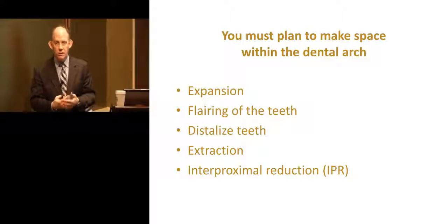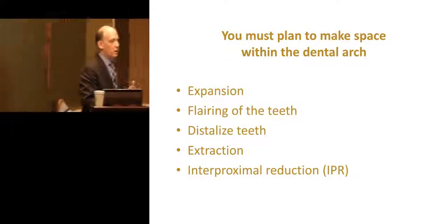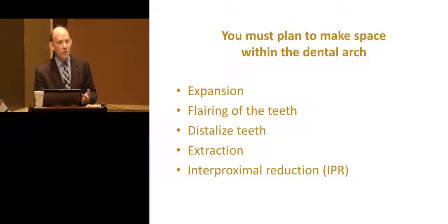So IPR and ARS has a couple different purposes in our world right now, one of which will be to make our teeth successfully move, but another will be to cosmetically reduce some of these ugly spaces we see in people that have very crowded teeth and a lot of bone loss. And I'll demonstrate this for you.